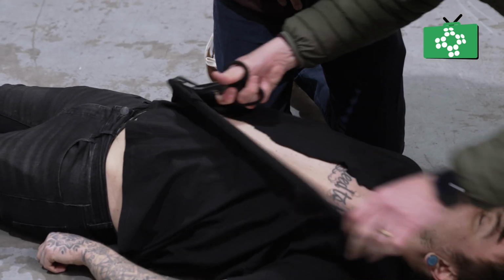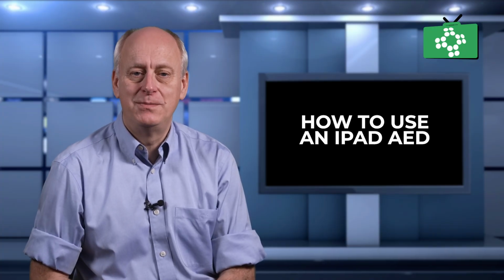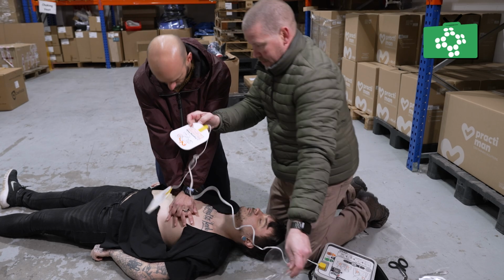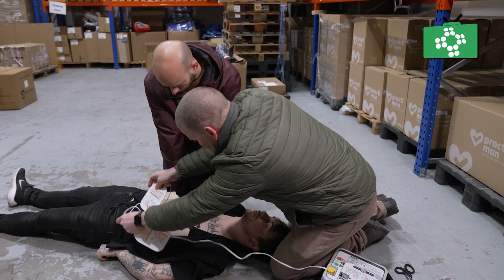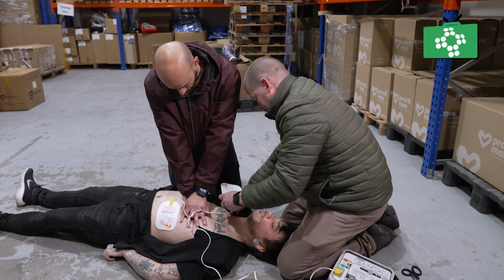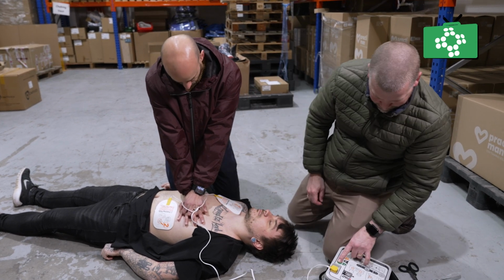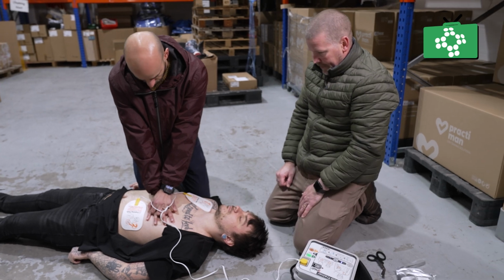Remove or cut clothing on the chest to ensure the pads directly connect with bare skin. This includes removing any bras or other items that may interfere with the pad placement or the shock process. Quickly inspect the chest area for pacemakers or surgical scars to identify if a pacemaker is present and avoid placing the pads directly over it. Pacemakers are usually fitted away from where the pads go.